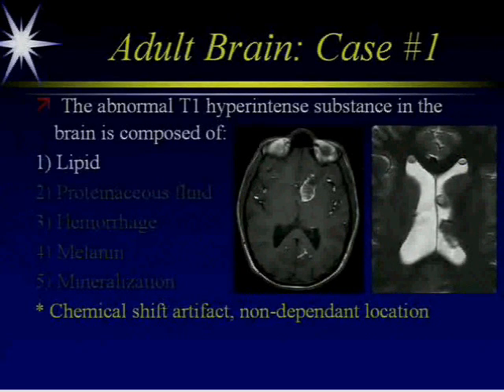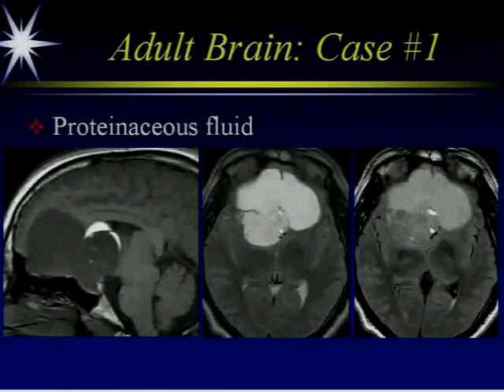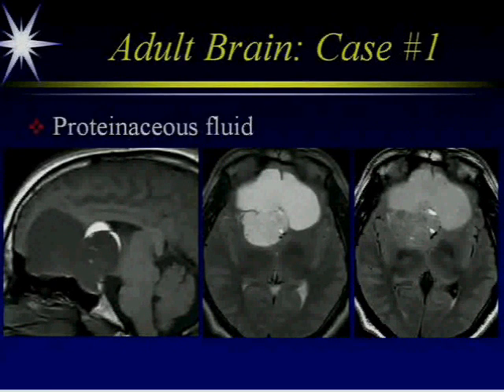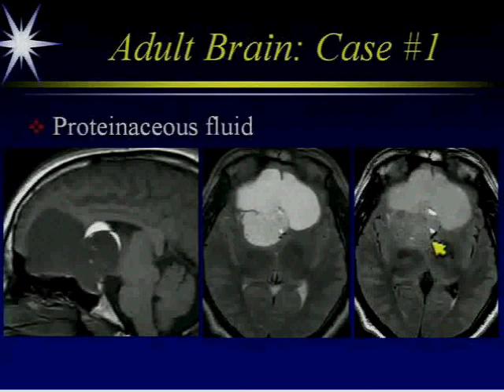All of those substances I mentioned are intrinsically bright on T1. Here we have a case of craniopharyngioma, and in the cysts of the craniopharyngioma are proteinaceous fluid. Depending on the concentration of the protein, you can get intrinsic T1 hyperintensity. You can see the protein content in this cyst — between the T2 and the FLAIR image it is not saturated out on FLAIR.